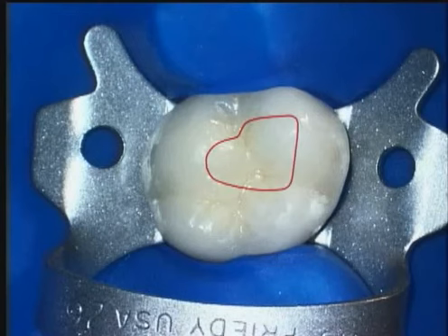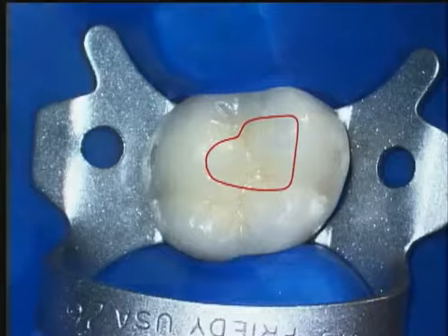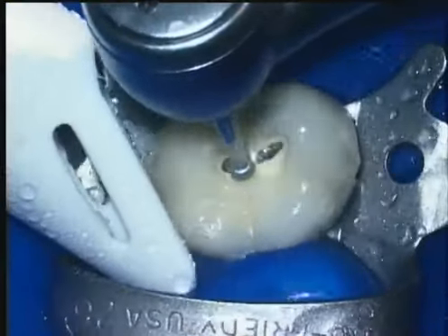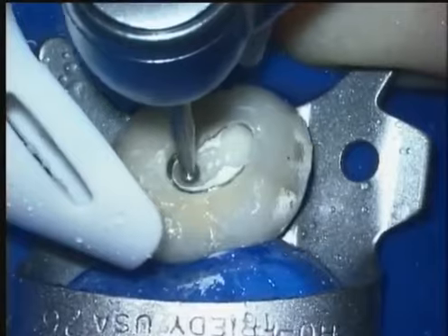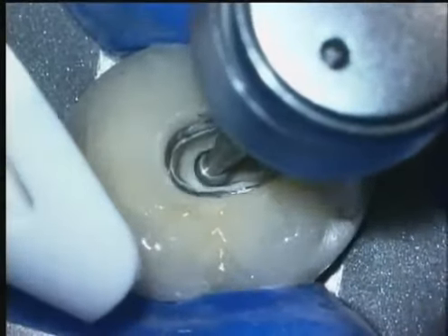The outline pattern guides our clinical actions, but in a maxillary first molar we need to be aware of the presence of an MB2, which is present clinically over 90% of the time. Therefore, the access cavity needs to be expanded at the expense of the mesial marginal ridge. A number 4 round diamond burr with voluminous amounts of water helps us make a safe window through the porcelain. A transmetal burr can make a window through the underlying metal, and then we use a surgical length round burr to drag up and de-roof the pulp chamber.